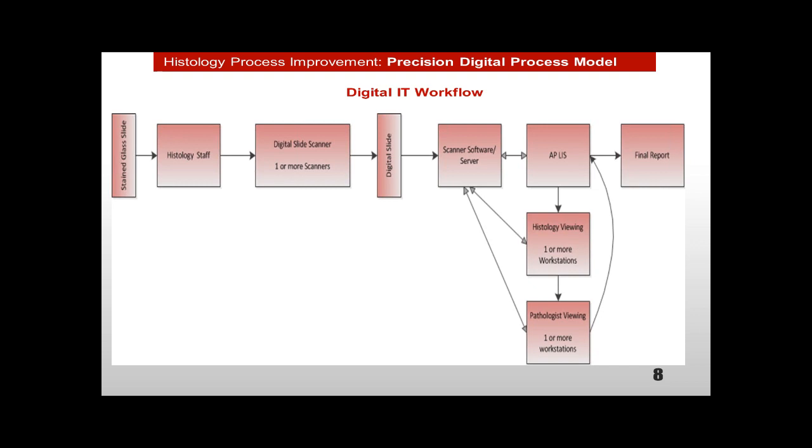So this whole time, histology has inserted themselves even more. And again, back to why you have to be a better partner with the pathologist and especially IT, is that now histology becomes even more important to make sure that all of this is integrated. Then it gets to the pathologist. That's one of the final steps. So there's a lot of steps in between here that sometimes seem like, we'll just bring in the scanner, we'll just stick in a couple of slides, we'll scan it, and everything will be better. There is a lot of time and effort in all of this.